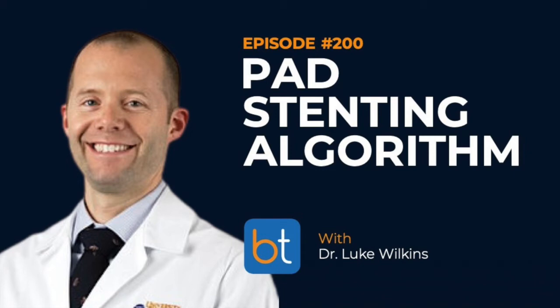Okay, so let's say you're going subintimal for a while. Any tips for early career folks about how to get back into true lumen? Yeah. Many of the times when we are doing subintimal recanalization, we will have spontaneous reentry below the level of the lesion. Spontaneous reentry occurs once we are in an area that has an open lumen, and we do not have significant atherosclerotic calcification within the vessel wall.